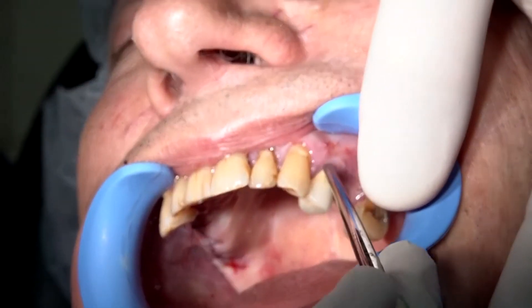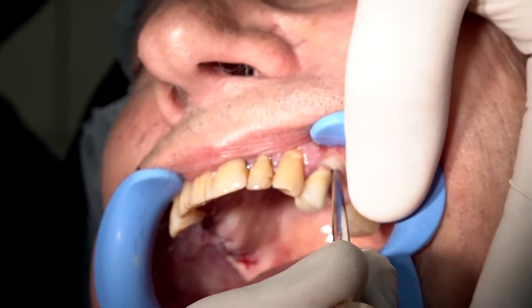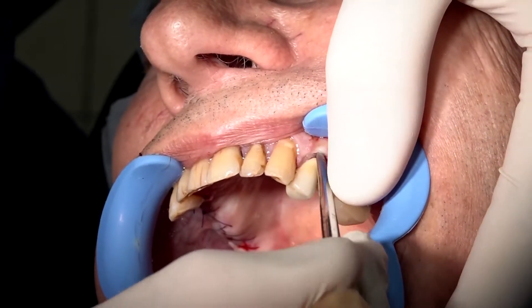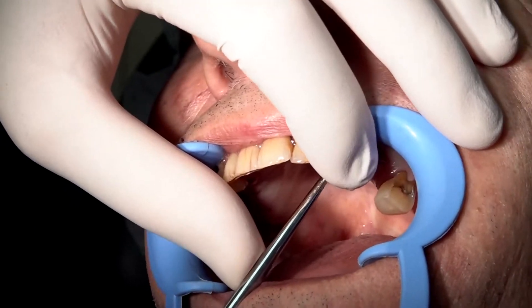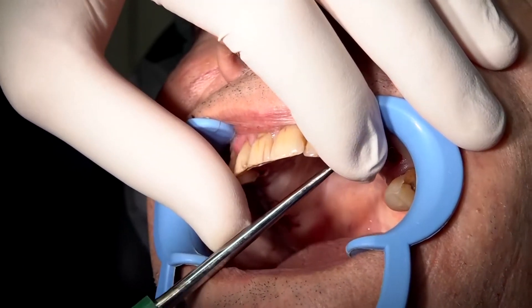In this case, Dr. Bahanes is going to extract the tooth and perform an augmentation procedure in the area in order to reconstruct the ridge. So, it is important to try to perform the extraction as less invasive as possible.